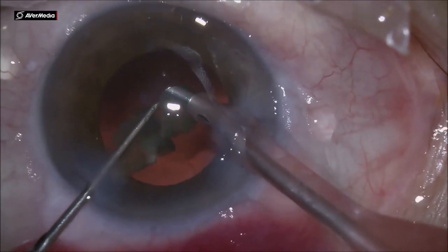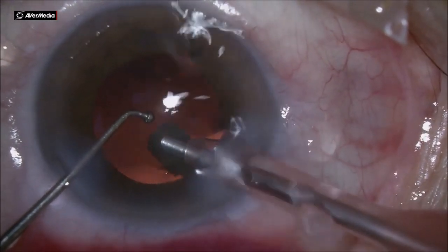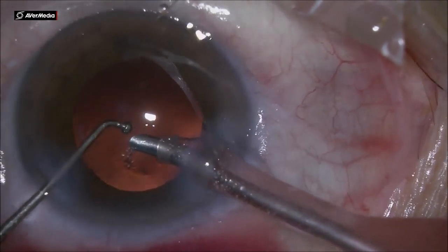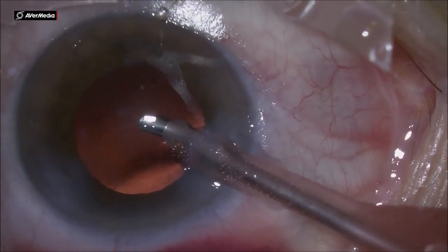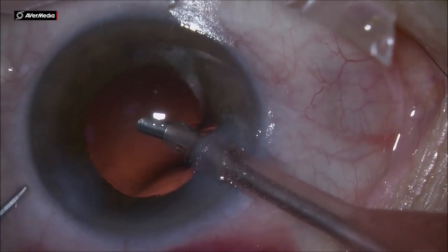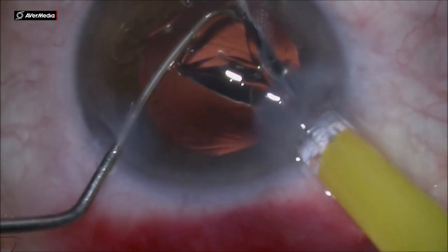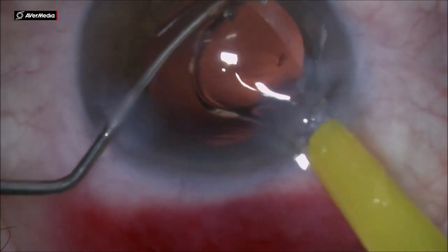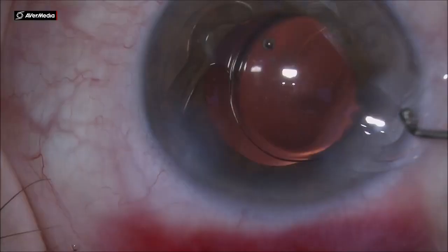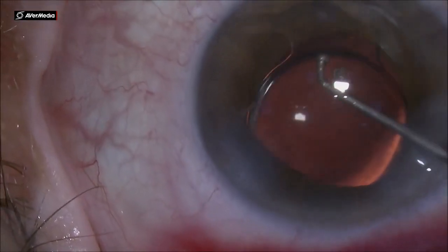At this moment we have something we didn't plan for, but it's a manageable challenge. You can see the posterior capsule rent — for the last part of the nucleus, the posterior capsule was coming forward and got aspirated into the phaco needle. It's no big deal; with viscoelastic plugged into the PC rent, and using the chopper, I am rotating and preparing to place the IOL.